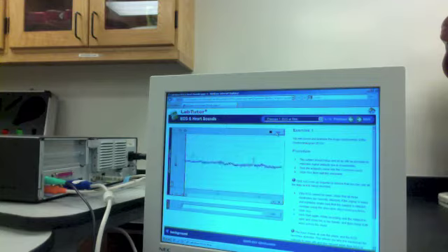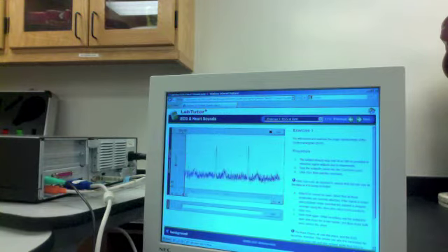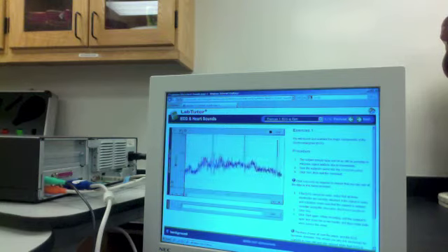Now, there are a few things you can do. We mentioned the fact that you can change the scale. All right, and the electrode just came off. By playing around with this, right? So this scrunches it up a little bit. You can see I'm seeing more of the record at a time. I can change the time like that to decompress it a little bit. Right, now we're back to normal. I can go up and down in size, so we're basically making it easier or harder to measure the amplitude of this. This little guy right here, which is the third button over, is called auto scale. It gives you supposedly what might be the best thing for you, and it's not so great, so I'm going to change that a little bit.